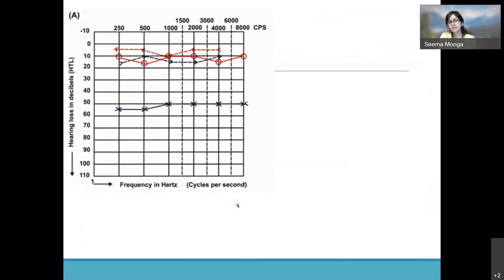So everyone, please look at this audiogram. What is the problem in this audiogram? The theory that I just told you. So the right ear is absolutely normal, but do you see the masking symbols here? No, there are no masking symbols in the right ear. All right, so this is one mistake. Here also no masking symbols in air conduction. Okay, so this is the right ear.